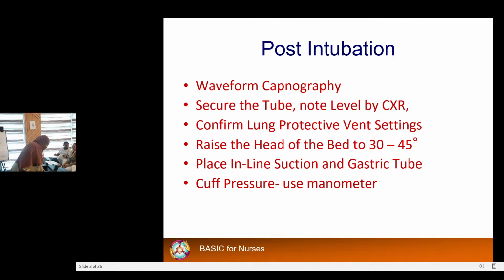Because it may cause swelling, edema in the airway. So you check where the arrow should be to make sure the pressure is appropriate, the green zone. So you should have suction and an ambu bag around. As I told you yesterday, if you want to extubate your patient, you have to have all the equipment ready for intubation, okay?